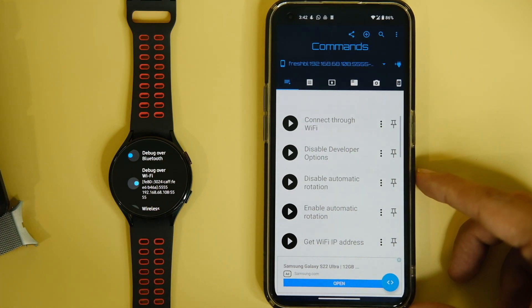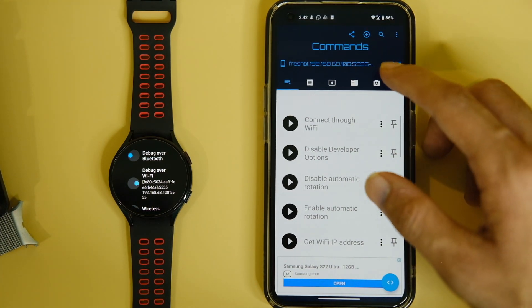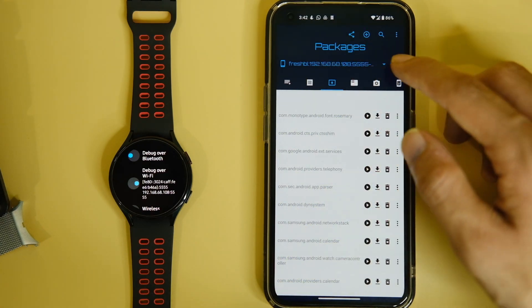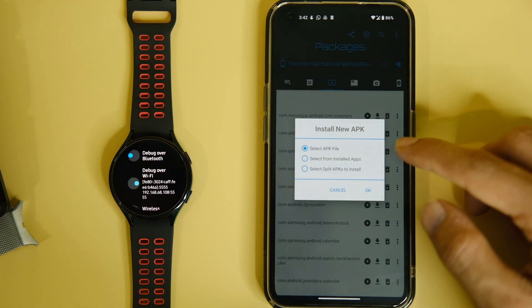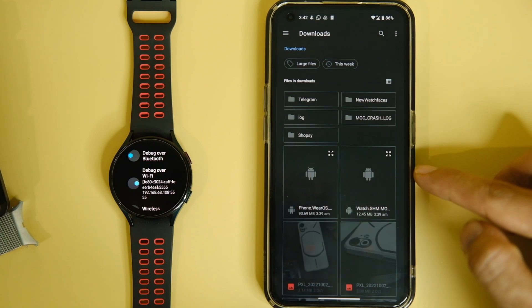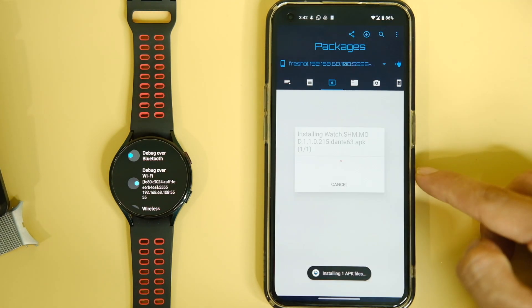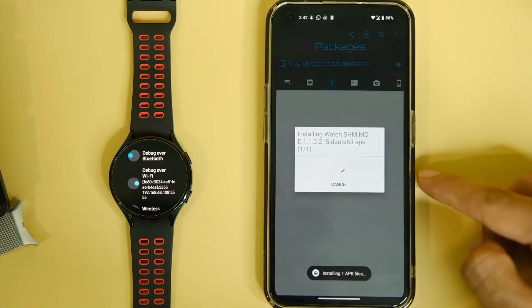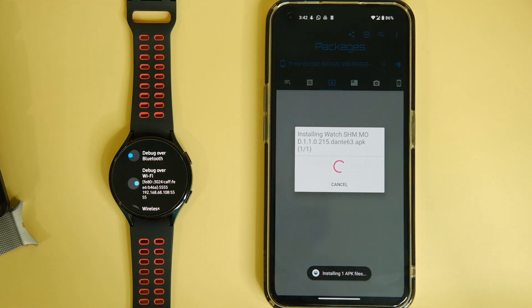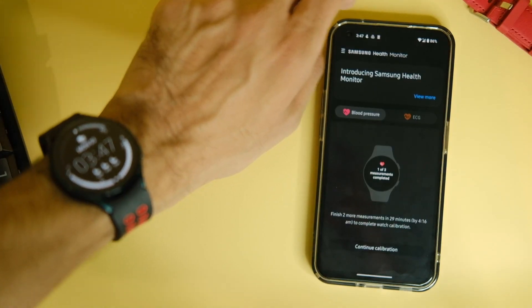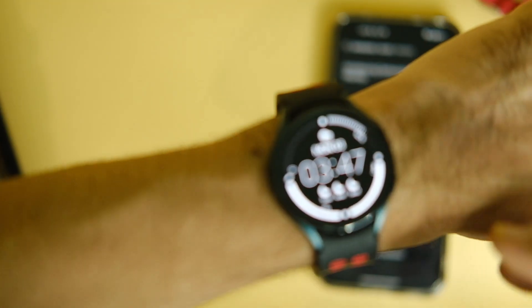After this, click on the third tab called Packages and here you basically have to choose the Samsung Health app for watch. Click on the plus button above, select the first option, click OK, and choose the watch SHM.apk file. This will start installing this application on your Galaxy Watch 4 — as simple as that. You will now be able to see the Samsung Health Monitor application on your Watch 4.